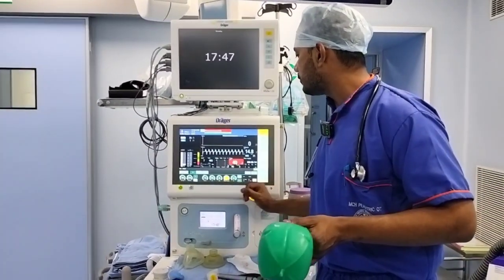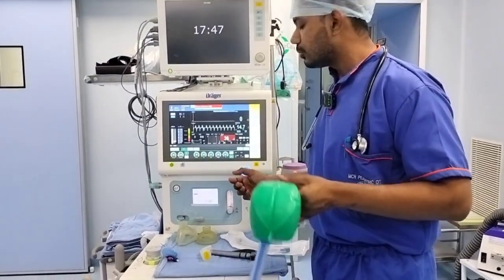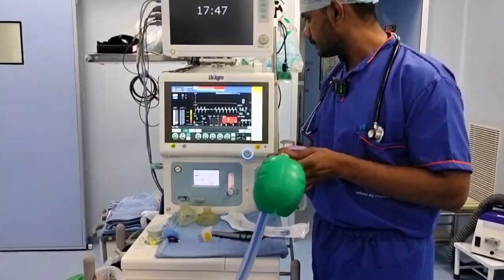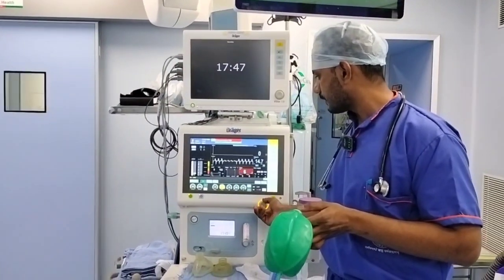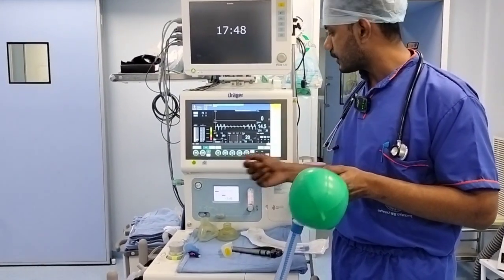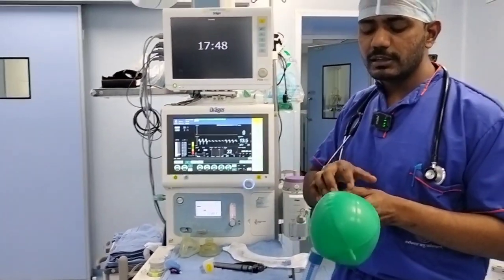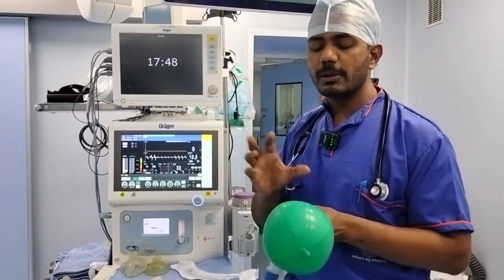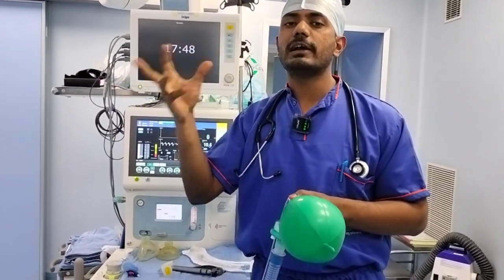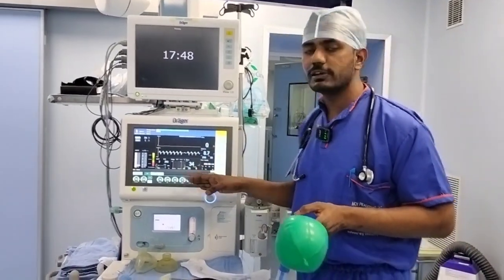So this is something called PEEP. For example, if we keep the PEEP at 0, you would see this test lung collapses more before even expanding. But if you keep the PEEP at some level, for example 9, you would see the lung is not completely collapsed. It remains open. In a similar way, we don't want the human lung to completely collapse and open again every time, because it will cause so much trauma, which is called atelectrauma. To prevent that, we usually have this trick.